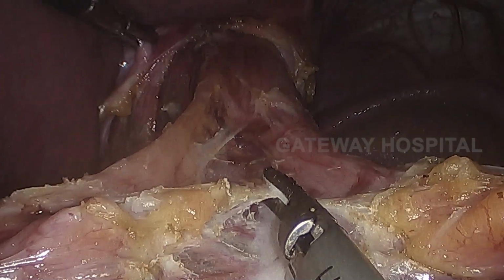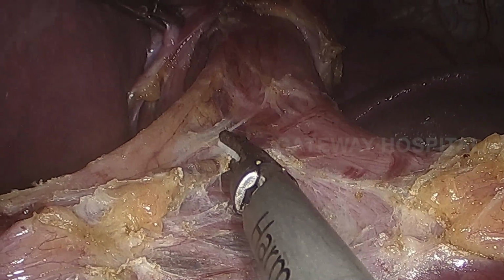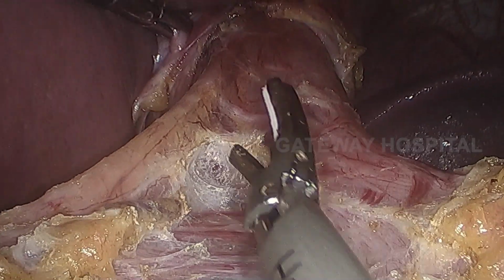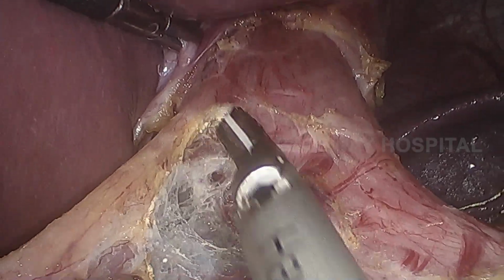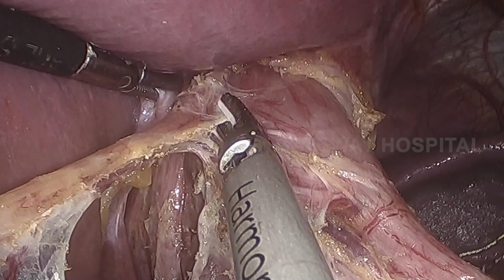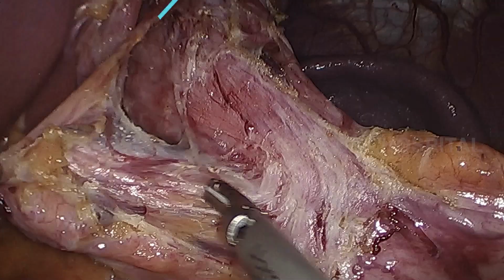While doing this step, there are two advantages. It will not come in between while doing the myotomy, and at the same time the anterior attachment of the esophagus is also lysed, so that what remains is only the muscular layer which needs to be divided during myotomy. Now you can appreciate the anterior vagus is completely mobilized.